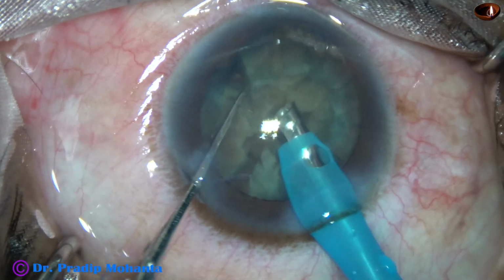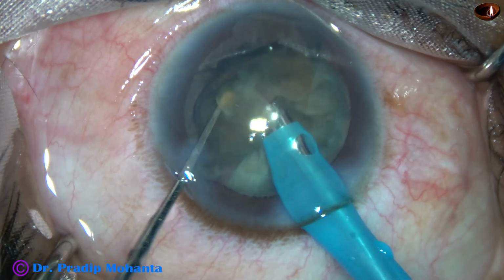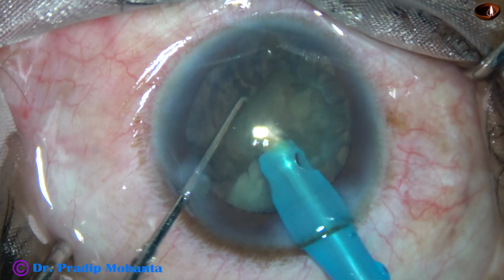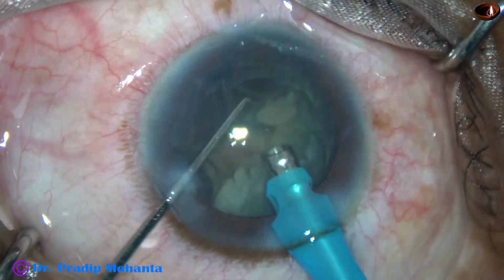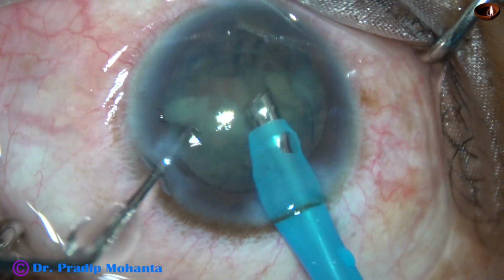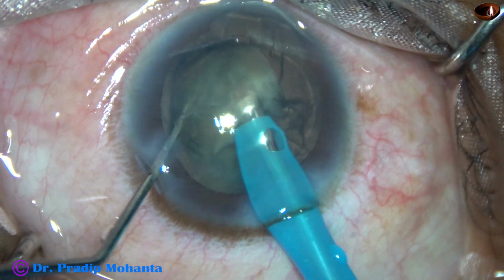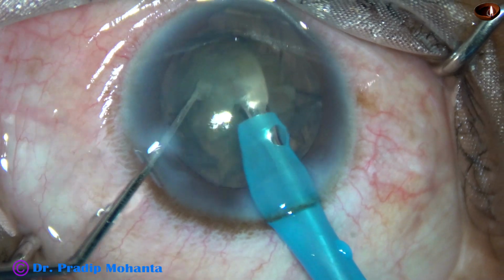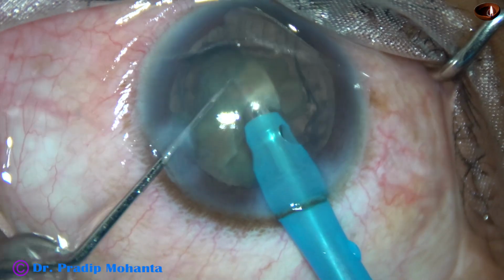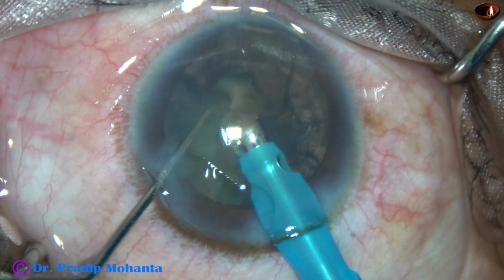And now my plan is to emulsify the nuclear pieces with low vacuum. I have decreased the vacuum to about 350 at this moment. And very slowly I am emulsifying the pieces. I am not in a hurry. I just want to do a nice job for this young gentleman. The patient is about 45 years old.